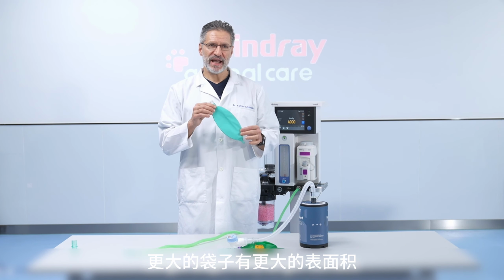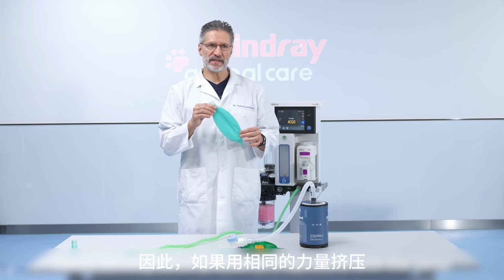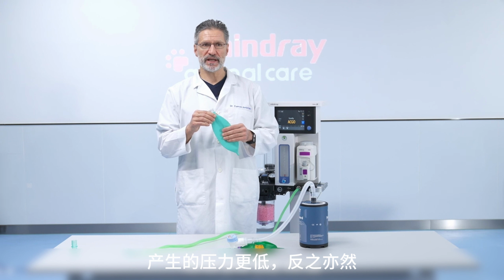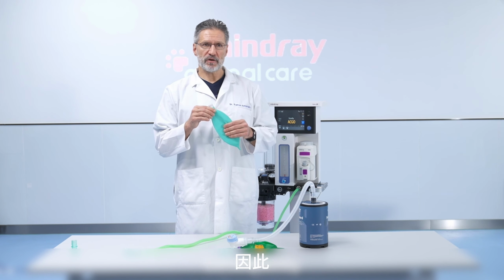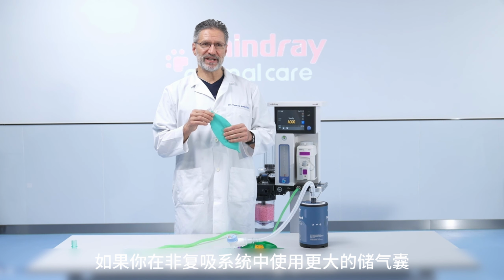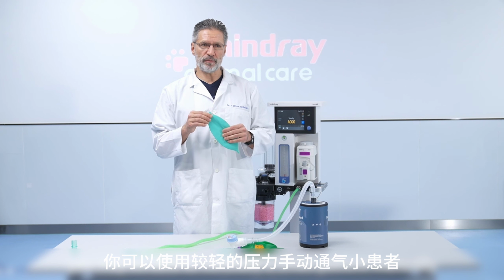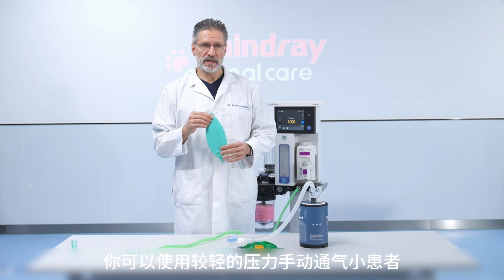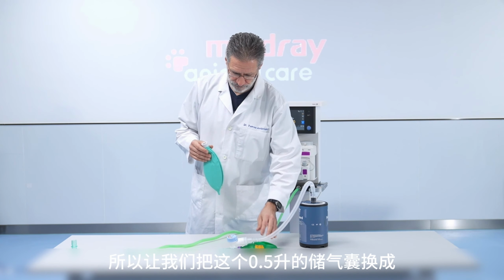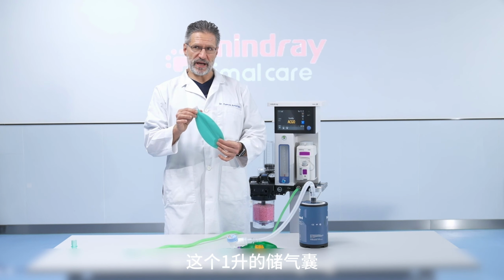Larger bags have larger surface, hence develop lower pressures if squeezed with the same force and vice versa. Consequently, if you use a larger bag with your non-rebreathing system, you may be able to ventilate a small patient manually with gentle pressures. So let's change this half-liter breathing bag here to this 1-liter breathing bag.